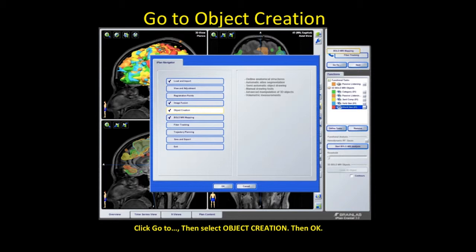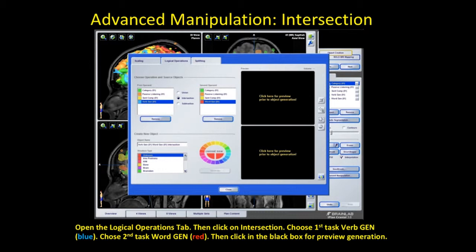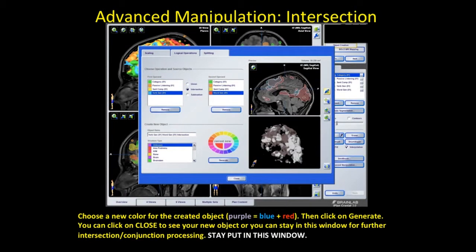Go to object creation and hit OK. Select advanced manipulation. Here's the advanced manipulation or intersection tab. Open the logical operations tab and click on intersection — that's what we want for the conjunction analysis. Choose the first task, verb generation in blue, then choose the second task, word generation in red. Click the black box for the preview generation. Choose a new color for this 3D object based on the intersection of blue and red — naturally, purple. Click generate. You can click close to view the new object, or stay in this window for further conjunction processing. We'll stay since we have more language tasks to add.